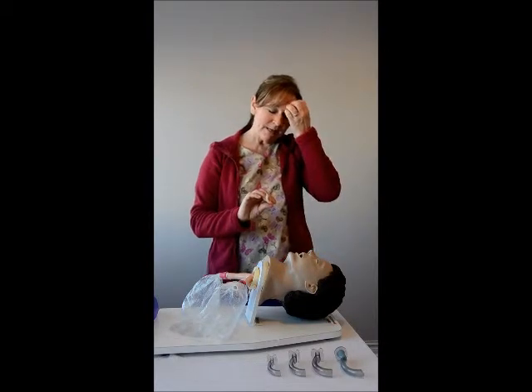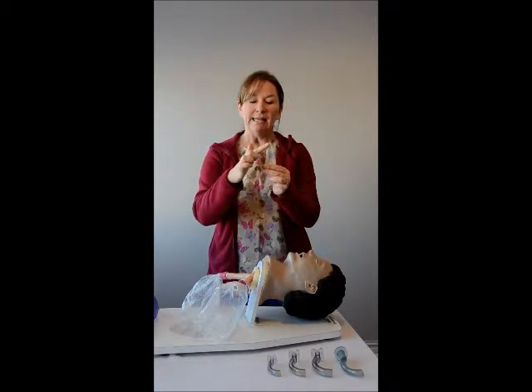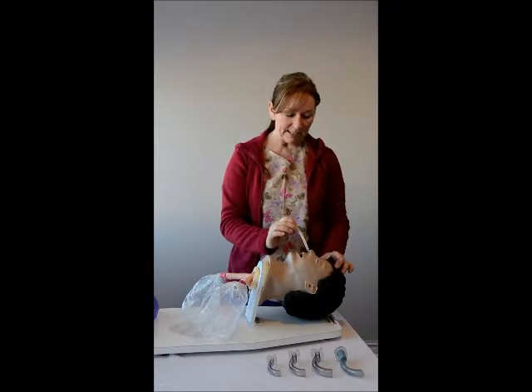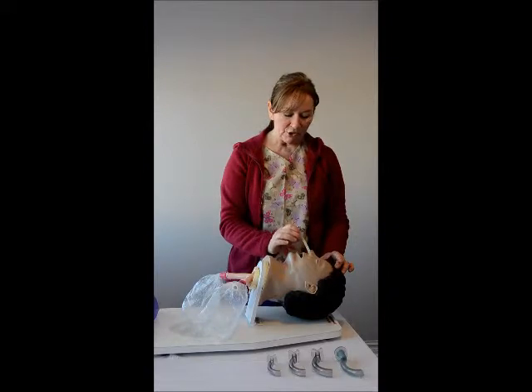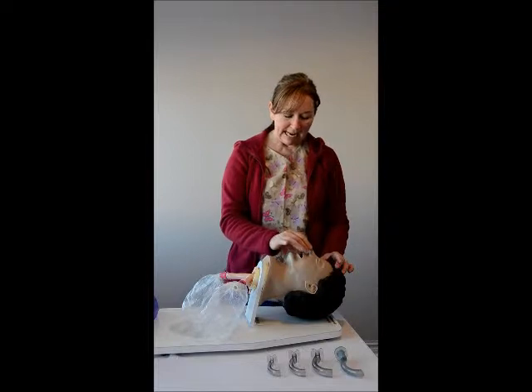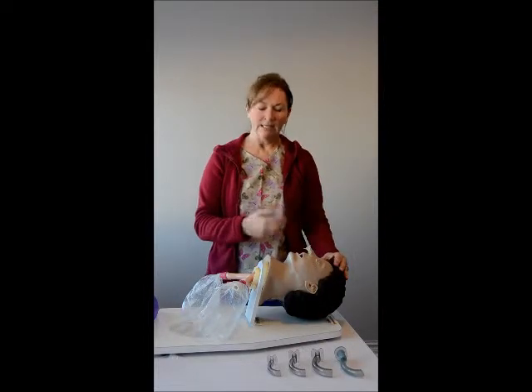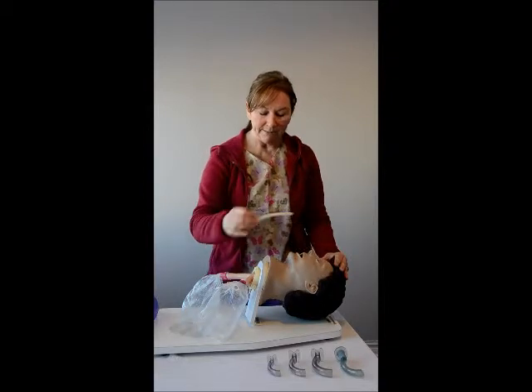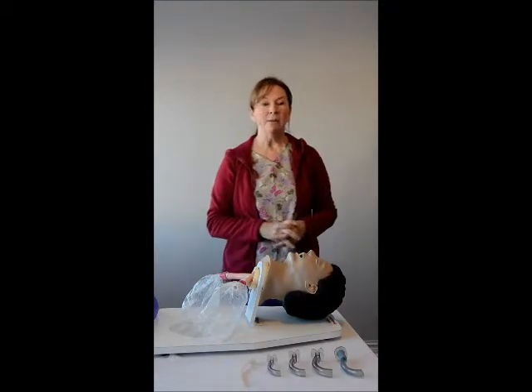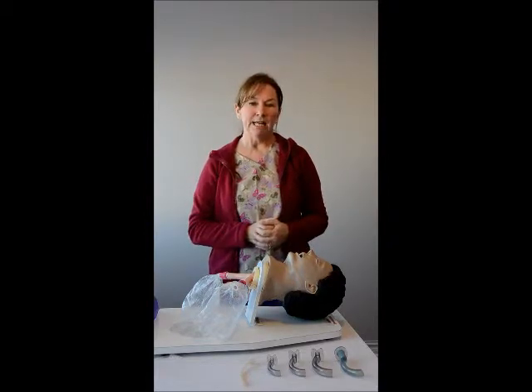When inserting the nasopharyngeal tube, make sure that the beveled edge is going in toward the septum. Ensure that your nasopharyngeal tube is well lubricated and insert without feeling any resistance. If you do feel resistance, do not continue beyond that. That is how we landmark for placement and size, and we've discussed the contraindications for both.